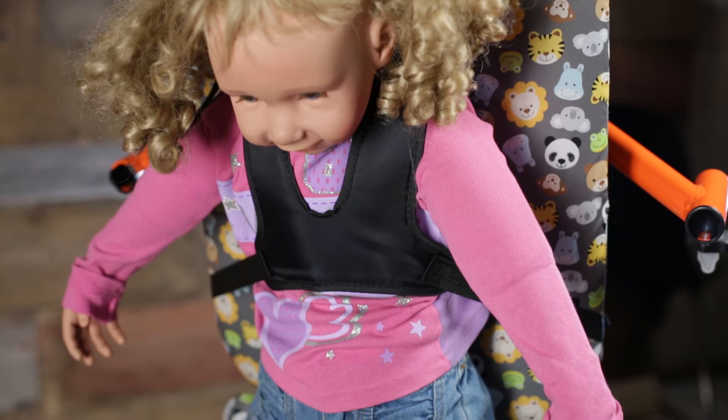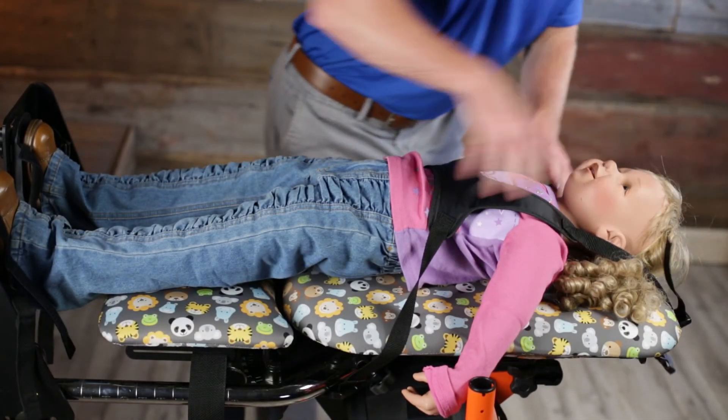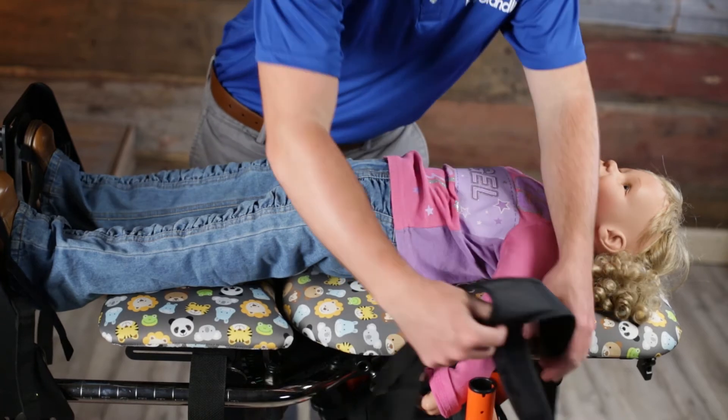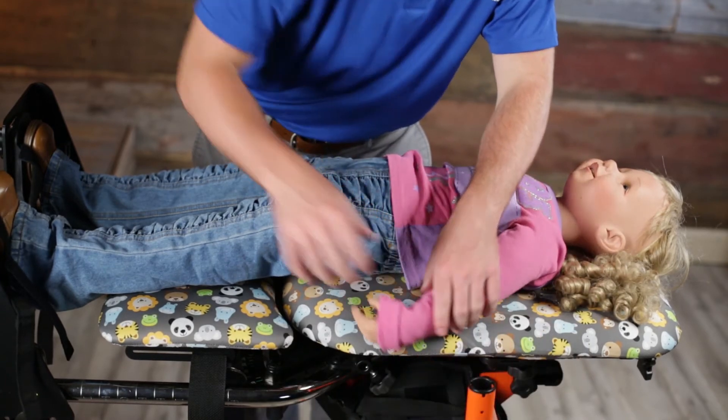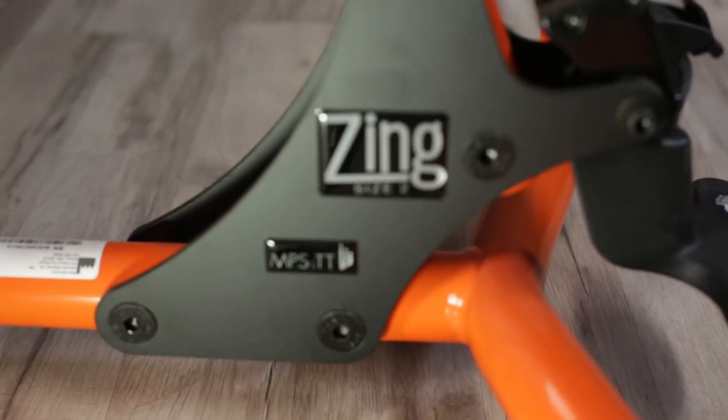The breathable mesh back accompanied by padding in the vest makes the non-stretch x-style chest vest a comfortable option for the user. To learn more about this option and the entire Zing line, check out zingstandards.com.